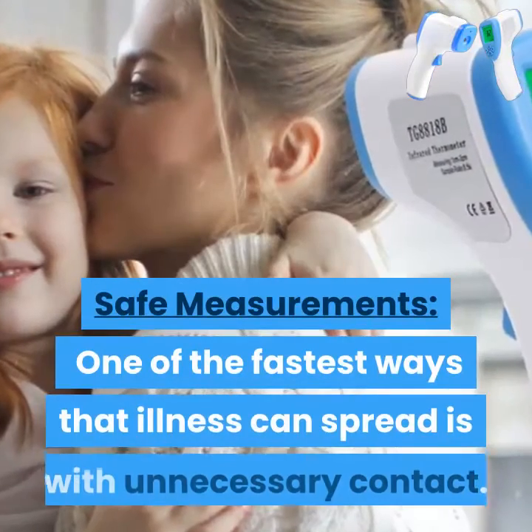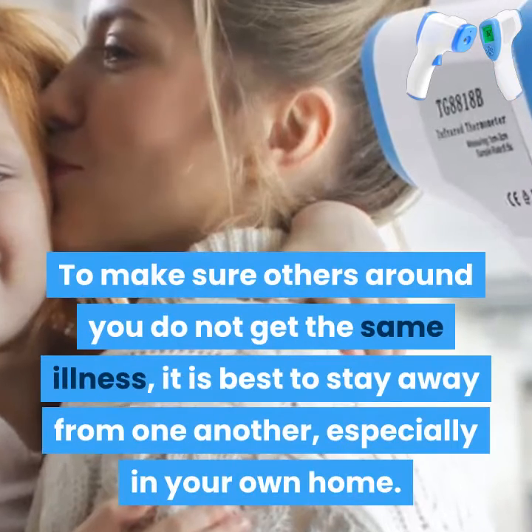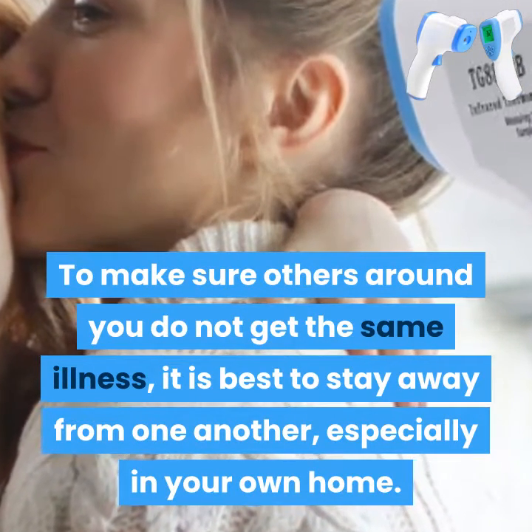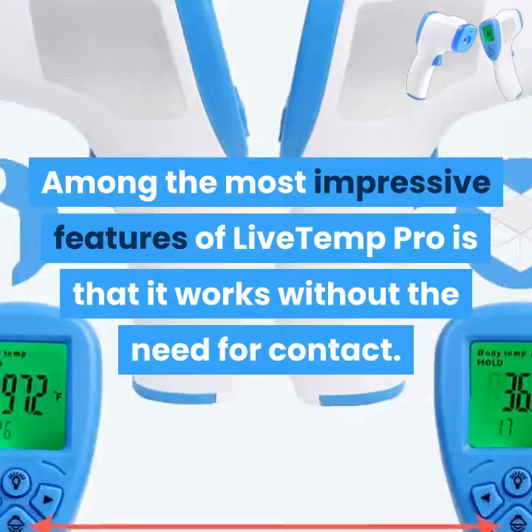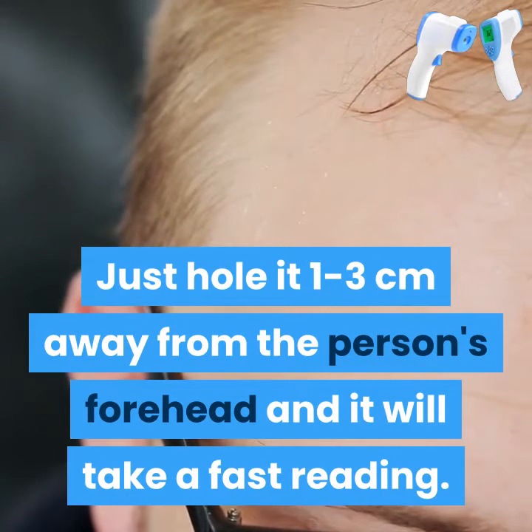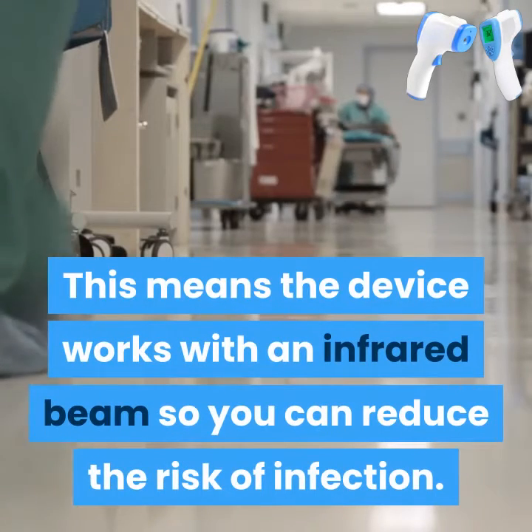Safe measurements. One of the fastest ways that illness can spread is with unnecessary contact. To make sure others around you do not get the same illness, it is best to stay away from one another, especially in your own home. Among the most impressive features of Live Temp Pro is that it works without the need for contact. Just hold it 1 to 3 centimeters away from the person's forehead and it will take a fast reading. The device works with an infrared beam so you can reduce the risk of infection.